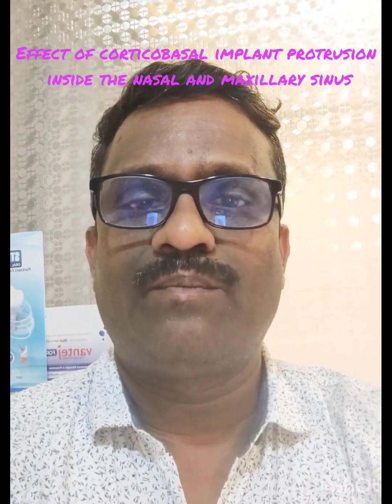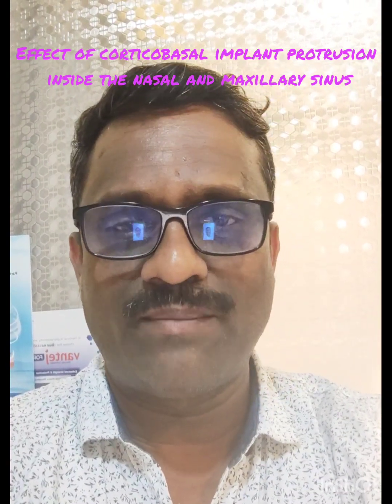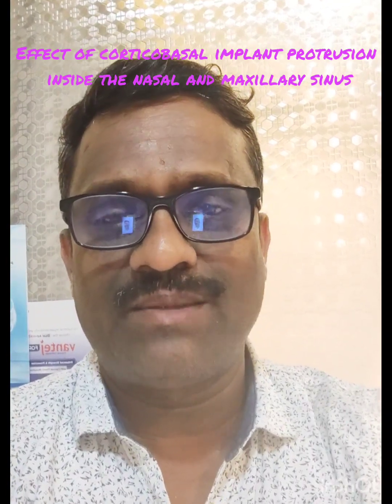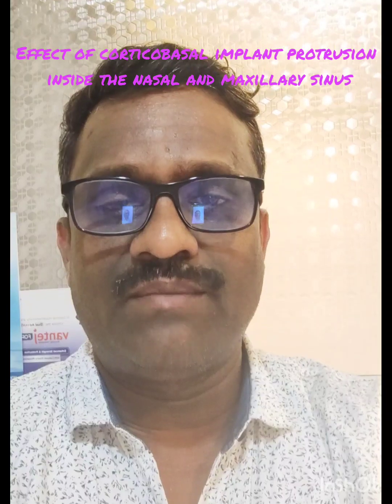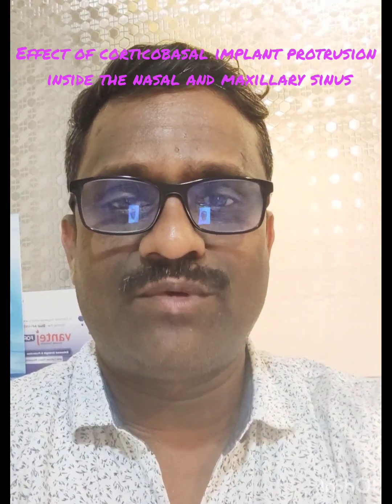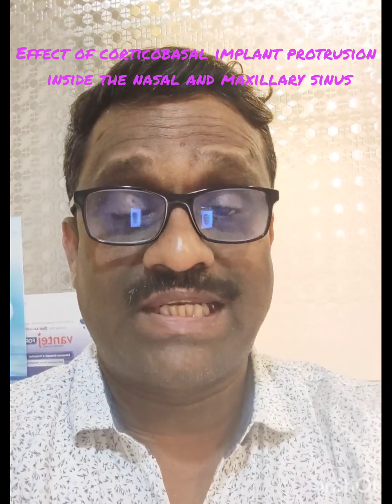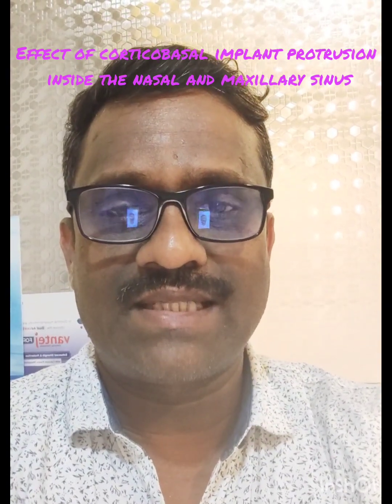Your implant may push the Schneiderian membrane, or the maxillary sinus floor membrane, to some extent, or in some cases it may penetrate the membrane also. What's going to happen when there is a penetration into the maxillary sinus through the membrane? If the penetration is up to 4 mm or sometimes more than 4 mm, when the 2 to 3 threads of your BECS, that is a polished surface cortical implant, are inside the sinus.